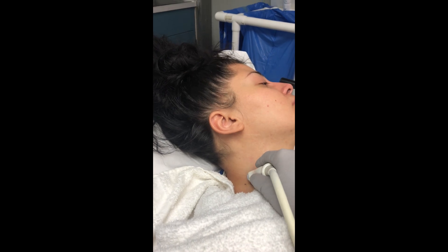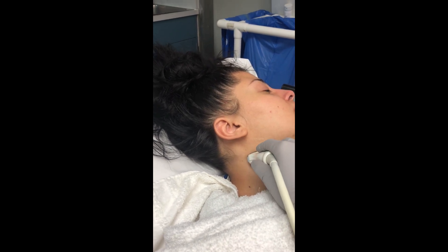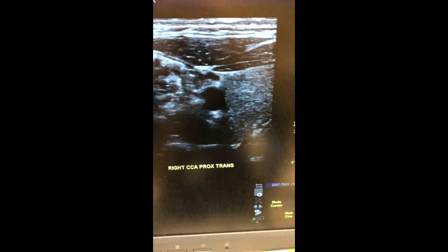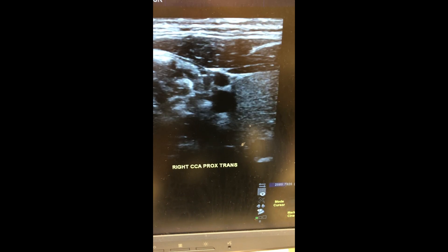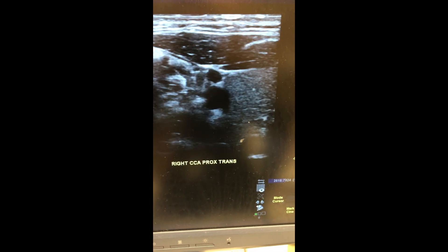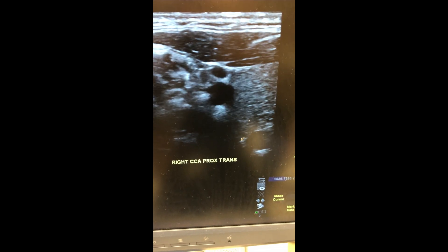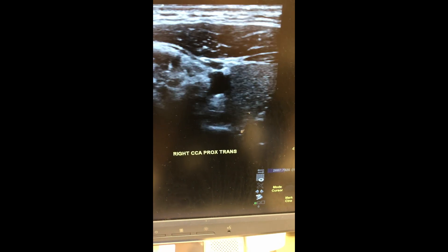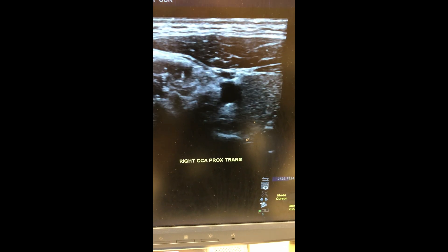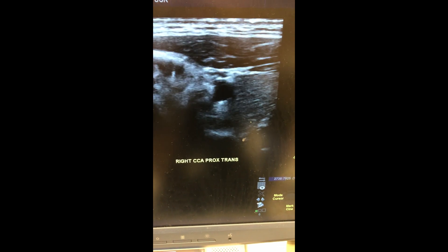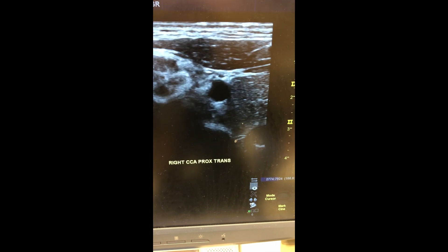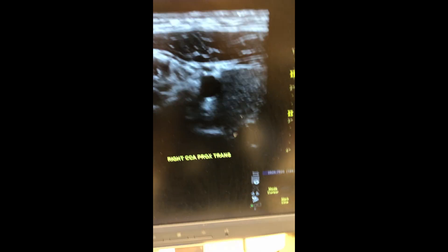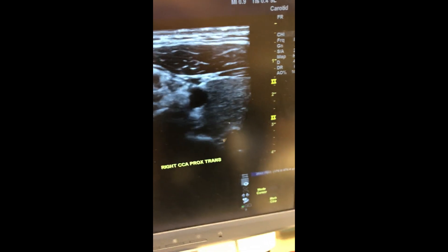The patient should be in the supine position with the head turned laterally. We begin the exam by surveying the vessels in transverse and sagittal, looking for any echogenic plaque along the walls or in the lumen. It is important to differentiate the artery from the vein — notice that the artery is pulsatile and the vein is compressible.